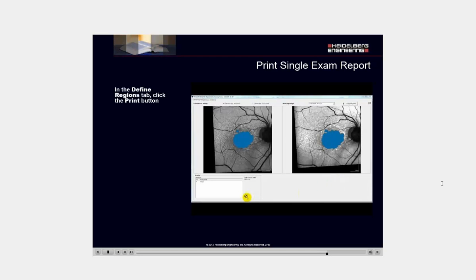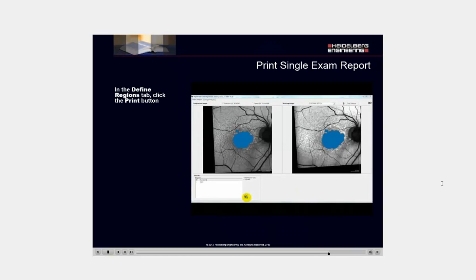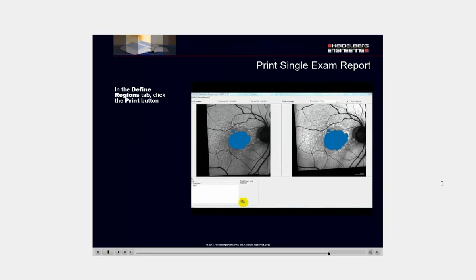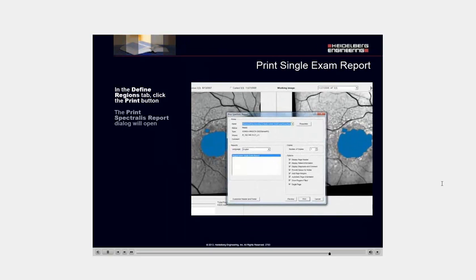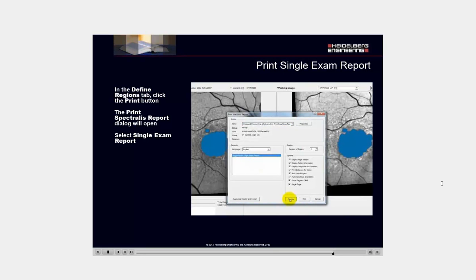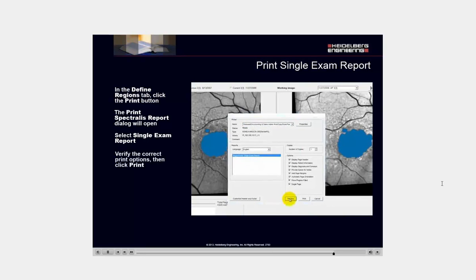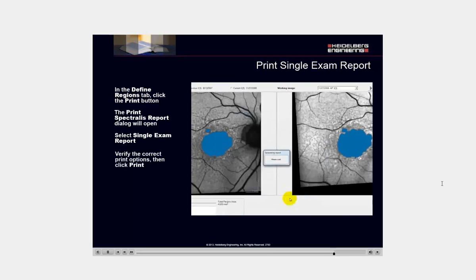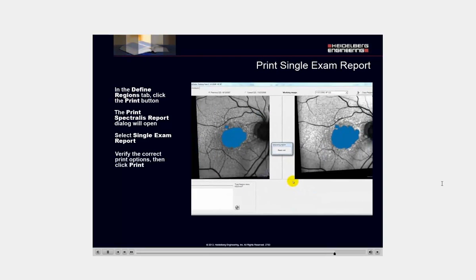In the define regions tab, click the print button. The print Spectralis report dialog will open. Select single exam report. Verify the correct print options, then click print.